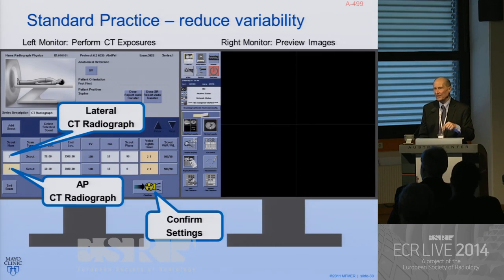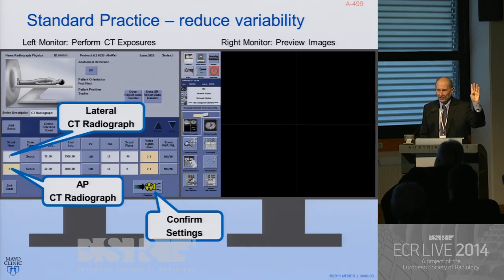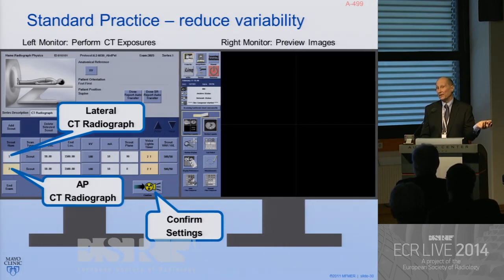And then I turned to them and I said, okay, how do you position the patient in the gantry? How many people use an AP radiograph? And half the group put their hands up. And how many people use a lateral radiograph? And some people put it up. Some people said, well, I just put them up and use the lasers. And I said, a physicist would tell you, if I could have my choice, we would all standardize and do it one way so that we could understand it. And so it just shows how we're all human. Everybody has a slightly different way of doing it. And if we can standardize on things, we get some of the variability out.